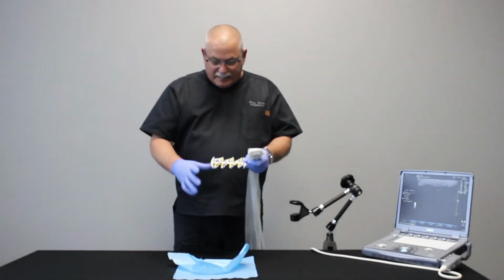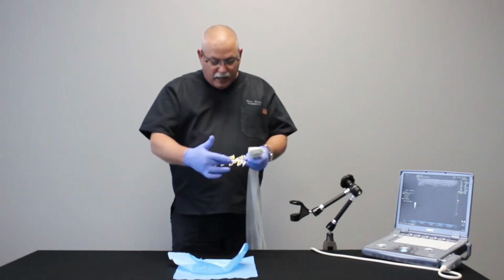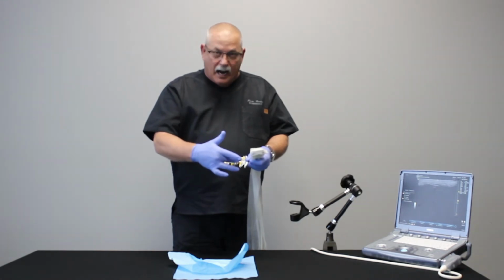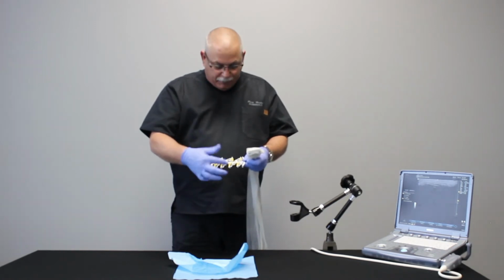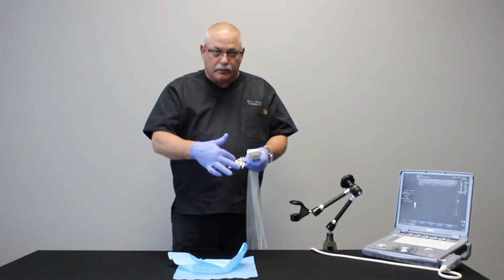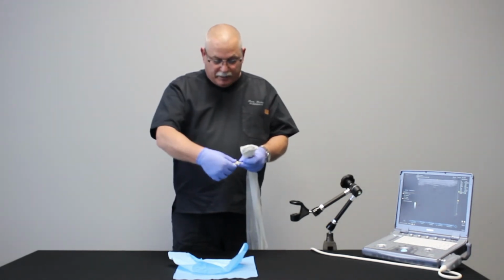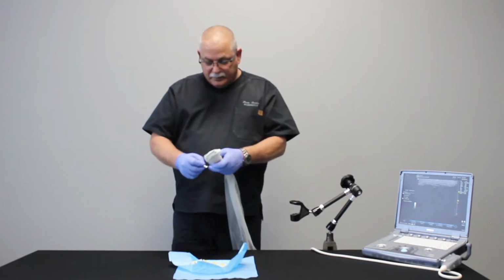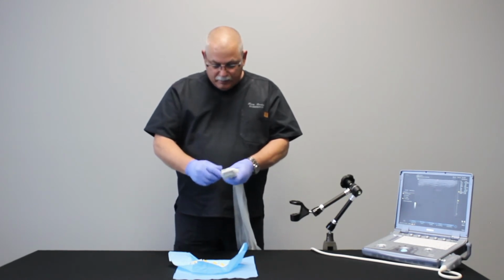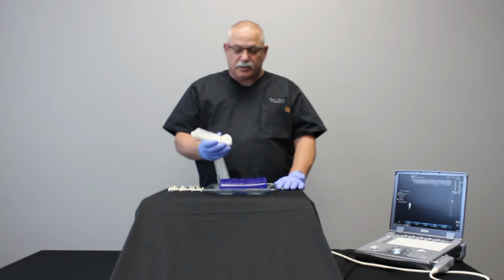So each AccuSITE kit comes gauge specific. So you'll notice these are yellow, that's for 20 gauge. I'll decide in a moment which actual gauge I will use because it's dependent upon the depth of the target. If you look at the numbers on each of these, they're specific depths. So if my target is 2 centimeters deep, then I would choose the 2 centimeter guide, and it attaches on the outside of the cover, like so.